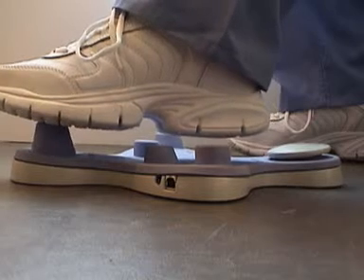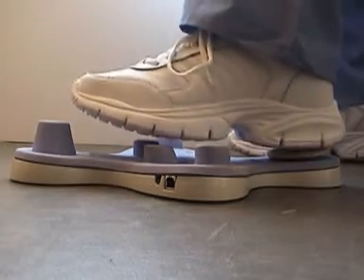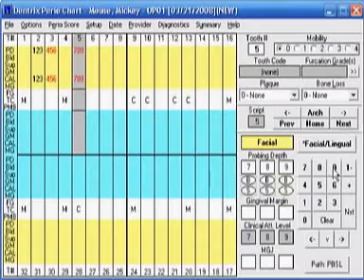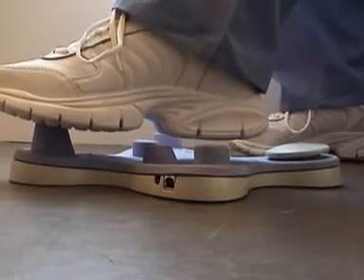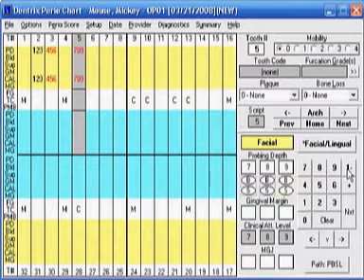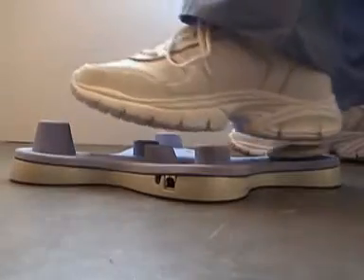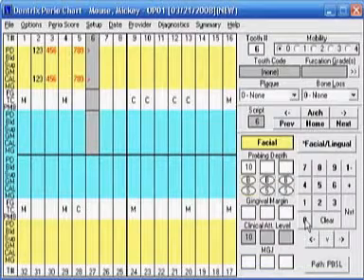If you have numbers higher than eight, there's a keyboard on your screen. Take your mouse over and put your mouse on the nine and then rock back with your heel and a nine will be entered. If you have numbers ten and above, go over to the one dash, rock with your heel — it's looking for a second number to be entered. So if you have ten, do the one dash, rock back with your heel, and then go to zero and rock back with your heel. A ten will be entered. On your chart you can see it's a greater-than sign because it can't display a two-digit number.